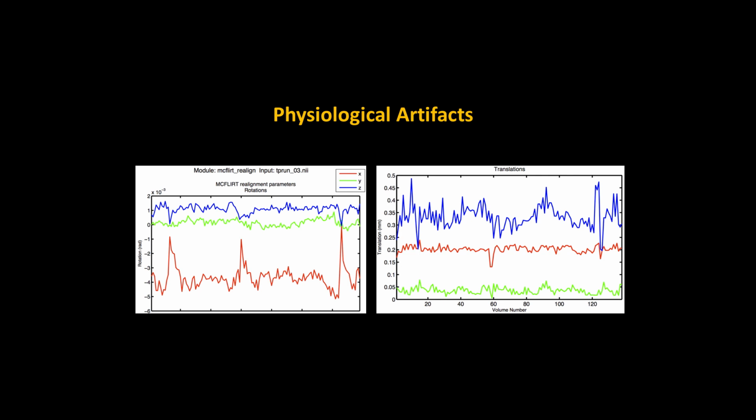And we also have rotations and translations. And one thing that's particularly difficult about motion correction is that, if people just moved right to the left, right to the right, just up, just down, that would actually be pretty easy to control for if they just did that, and if they did that at a steady rate every time that they moved. But because they're not that compliant, usually they're more complex motions that combine both translations and rotations, which is why some people advise including motion derivatives in your model to account for those more complex motions.